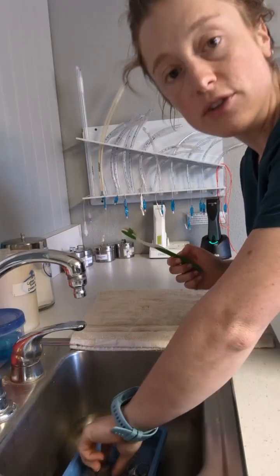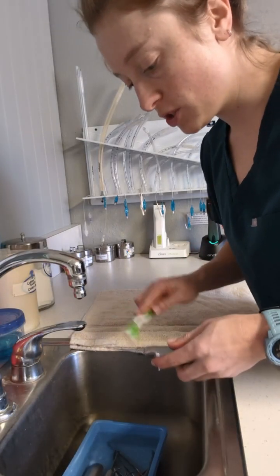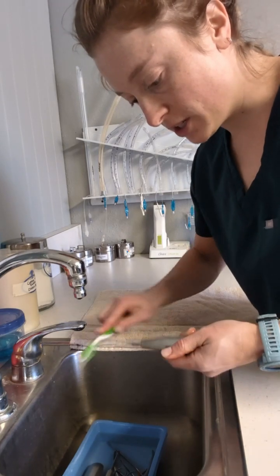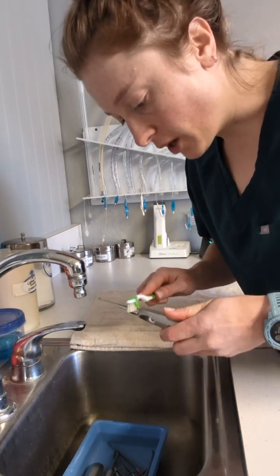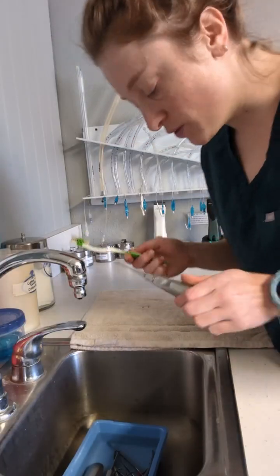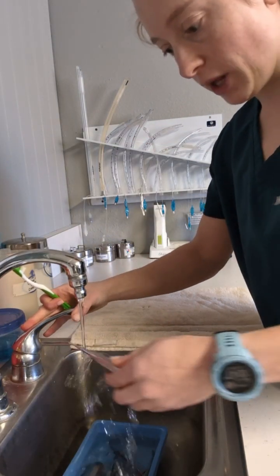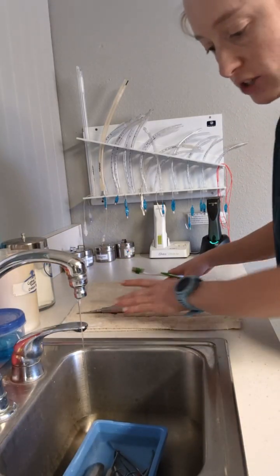After the instruments have been soaking, I'm just gonna brush them with a toothbrush just to get any big debris or blood off, making sure that they just visually look clean. And I want to give a rinse and then let them dry just to the side.